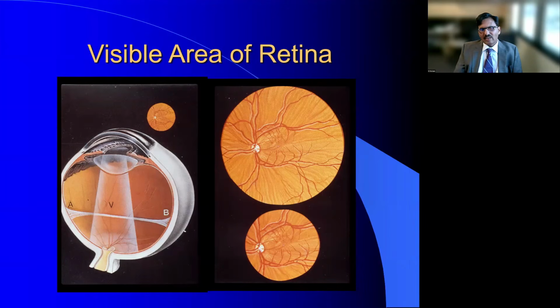So this is an animation that is comparing the indirect system versus a direct system. As you can see, V represents the direct ophthalmoscopy that I described earlier, which is around only 4 square centimeters of retina. With indirect, you can see A to B, which is now around 7.5 to 8 square centimeters. You still have 4 centimeters that you don't see that is anterior to the equatorial region unless you scleral depress, which is a painful procedure in the clinic, but in the operating room, because the eye is anesthetized, it is relatively easier to do and less traumatic.